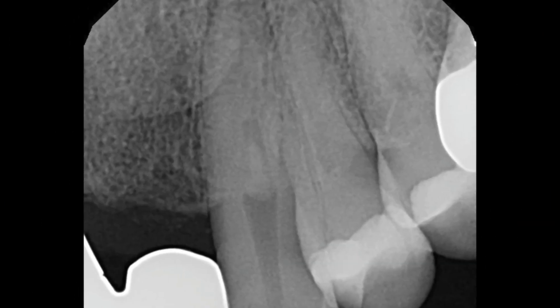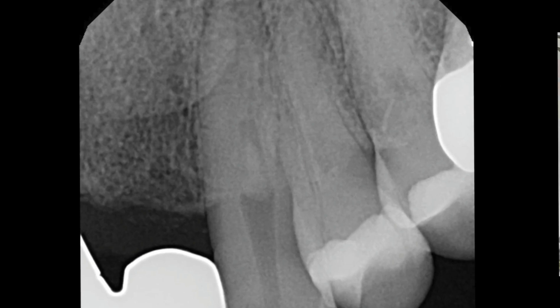This massively large calcification in the middle of the tooth completely strangulates the pulp, which essentially results in the death of the coronal part of the pulp. It's very difficult to get through these. I've seen a lot of them, and there's often apical calcification and constriction going on as well. I'm going to show you how ultrasonics are helpful in removing them.